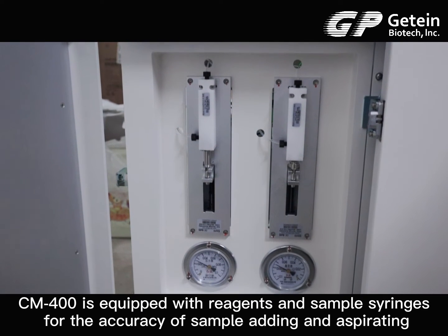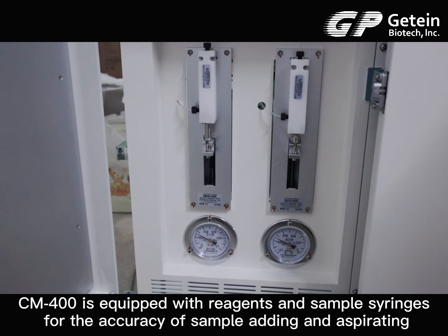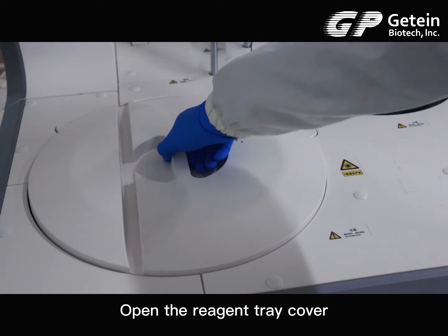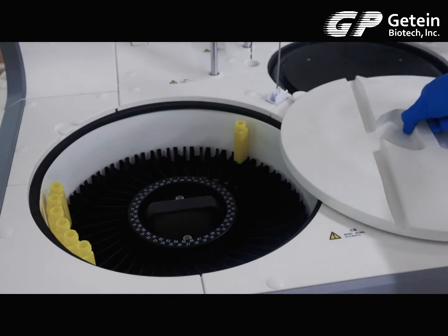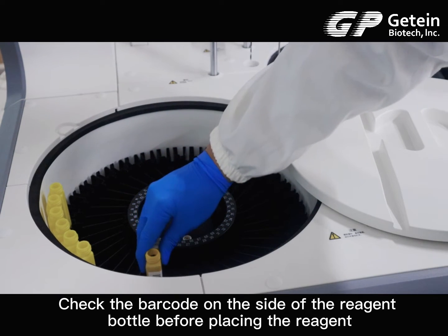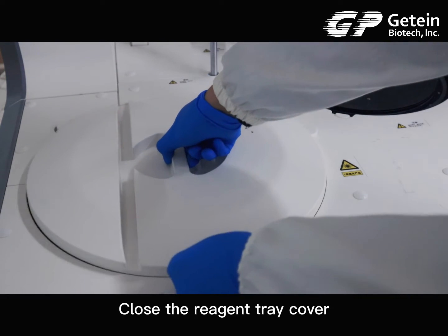CM-400 is equipped with reagent and sample syringes for the accuracy of sample adding and aspirating. To load a reagent: open the reagent tray cover, check the barcode on the side of the reagent bottle before placing the reagent, place the reagent in the reagent tray, then close the reagent tray cover.